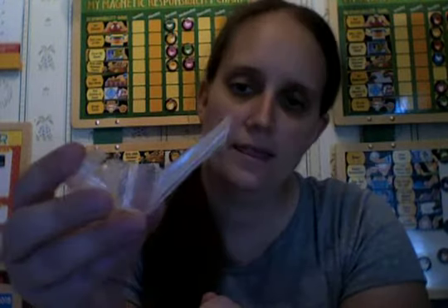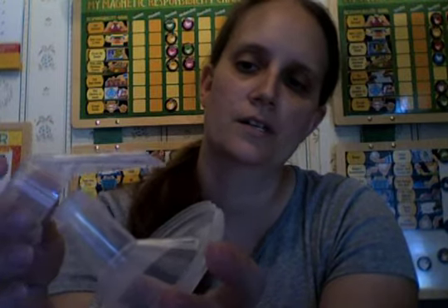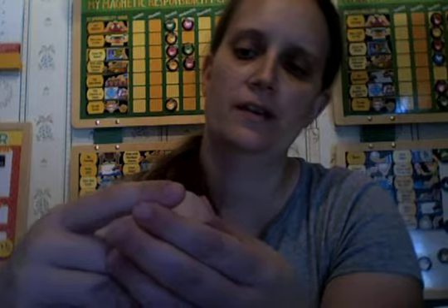So you get those, you get this little thingy, which is your valve, and these. When you put your Freemies together, boil your parts first. Very important. If you don't boil them, they're going to leak. And you're going to have to do it probably several times while you're using them, maybe like once a week, depending upon how long you use them. But anyway, there's a little notch up here, and that's where your tubing is going to go. So this is going to go on here, and it's going to line up with that tubing, like where that hole is. So you put that in there and you push it.